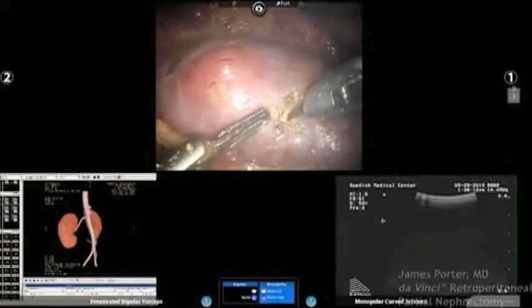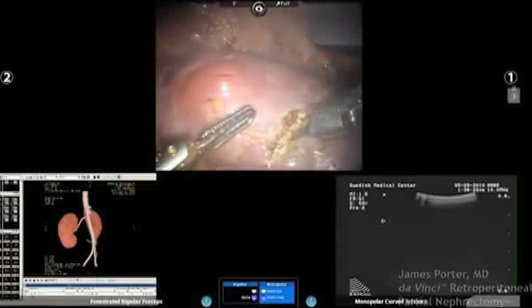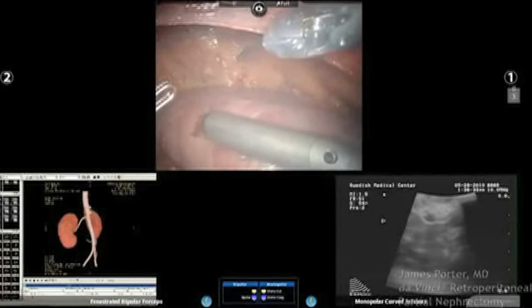What's the rate here of her breathing? Yeah, I know. Okay, let's go side to side. Yes, get flat on the tumor, please. I need the whole thing on the surface. No, deflect your wrist up.